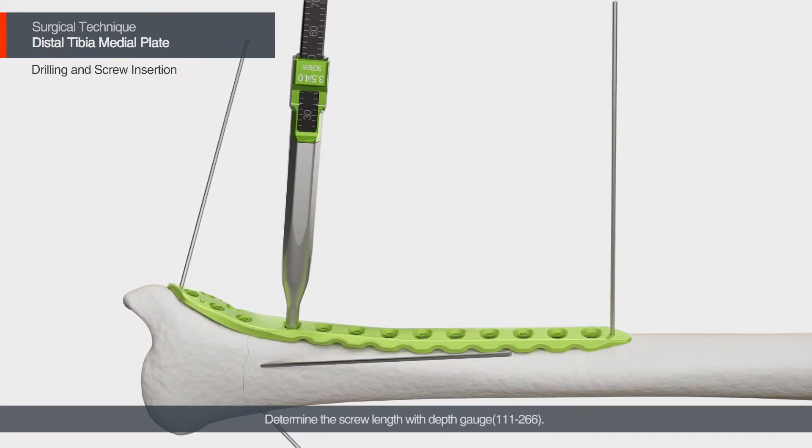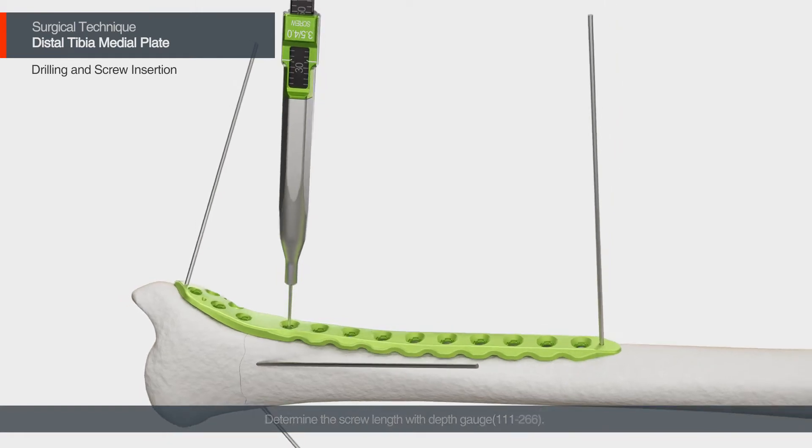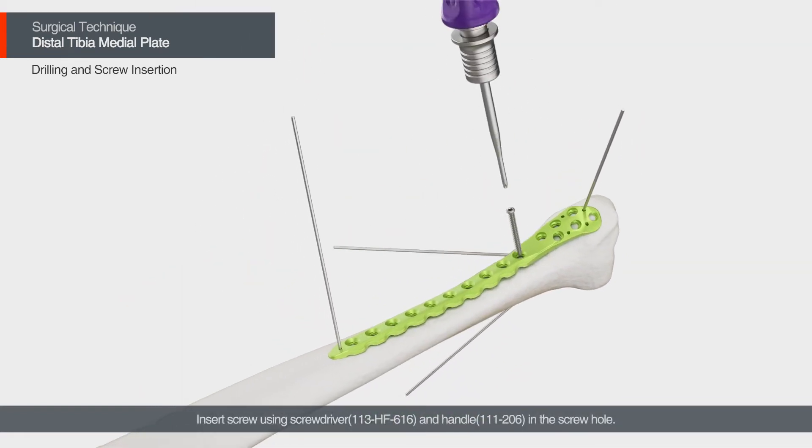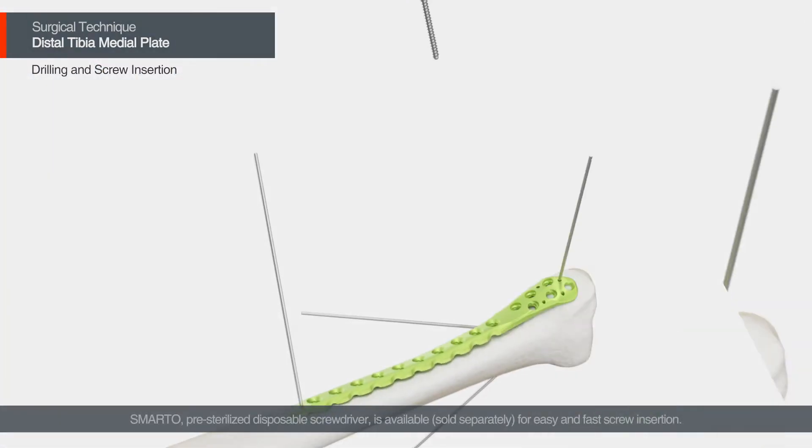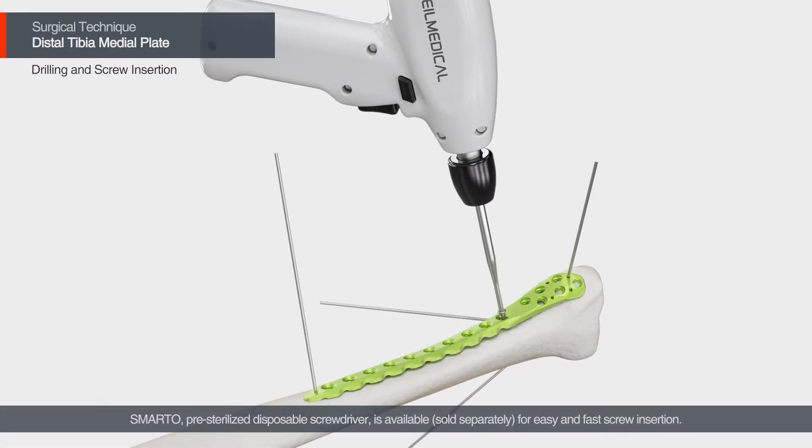Determine the screw length with a depth gauge. Insert the screw using a screwdriver and handle in the screw hole. The Smarto pre-sterilized disposable screwdriver is available for easy and fast screw insertion.